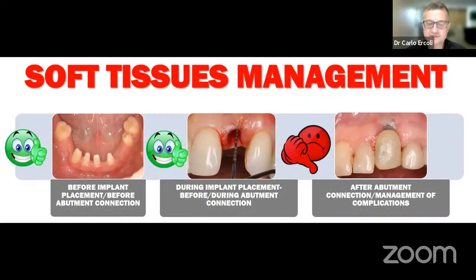So, having spoken now at length about soft tissue, there are going to be some situations when that soft tissue management needs to be enhanced a little bit. So let's discuss a little about soft tissue management. Soft tissue management can occur before implant placement or before abutment connection, or during the implant placement or during abutment connection, and both of these are potential positive strategies. As a negative strategy, to make up for complications, it can be done after abutment connection and generally in the management of complications. So we certainly want to avoid the latter.